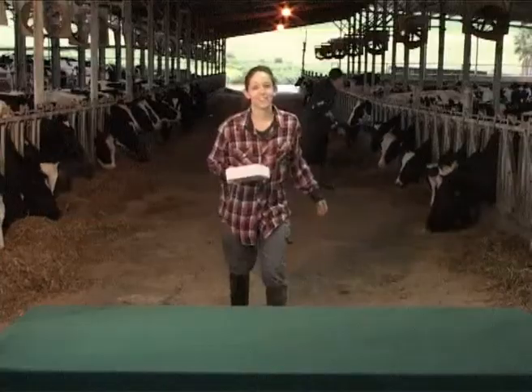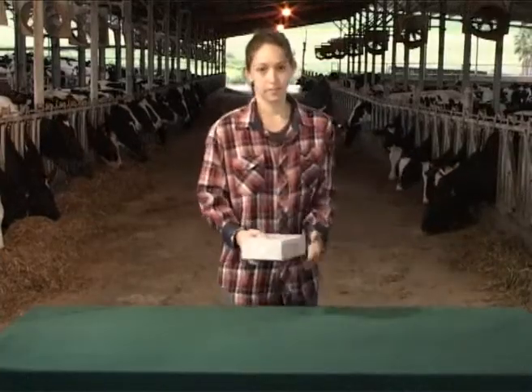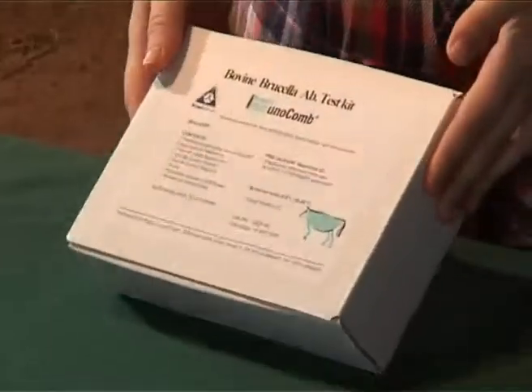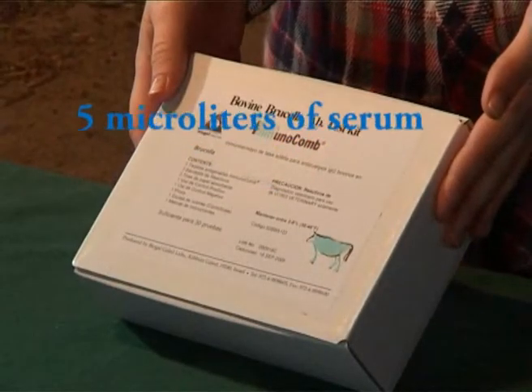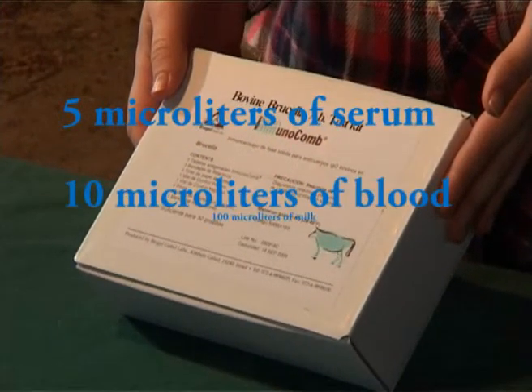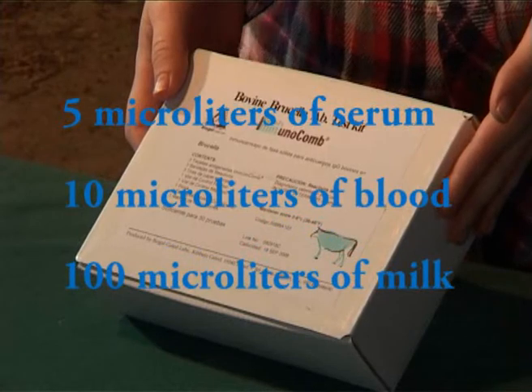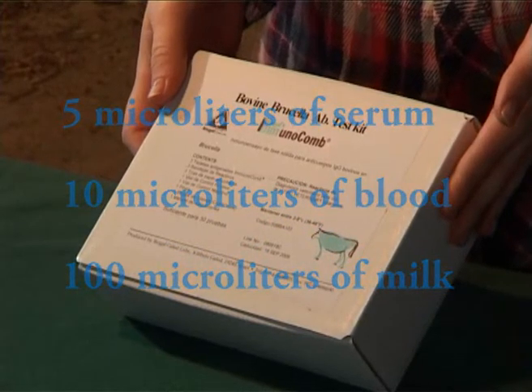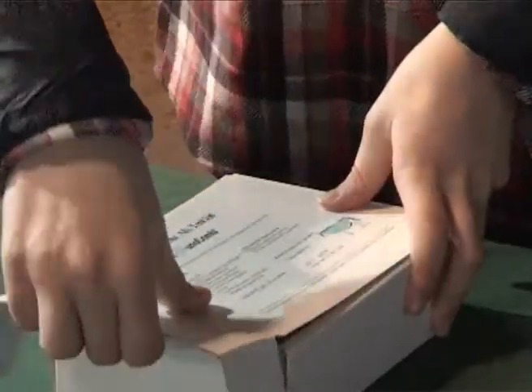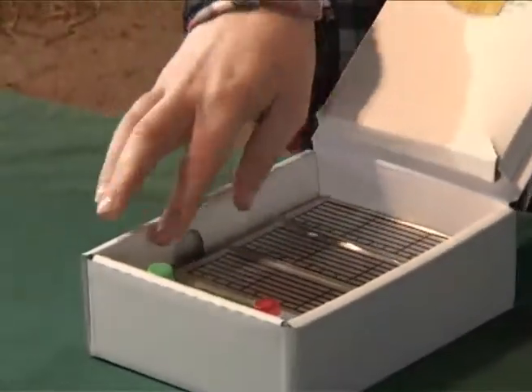The kit should be stored under refrigeration. Before conducting the test, the kit should be at room temperature. It is possible to carry out the test with five microliters of serum, ten microliters of blood, or a hundred microliters of milk. In the latter case, the analysis can be carried out on the farm without any need for an invasive procedure.